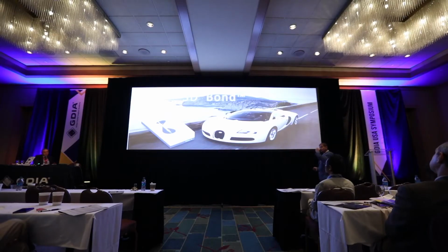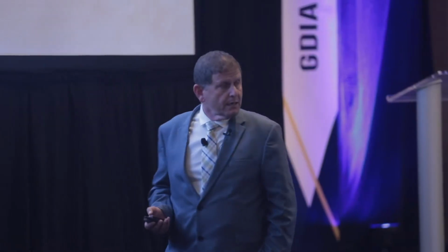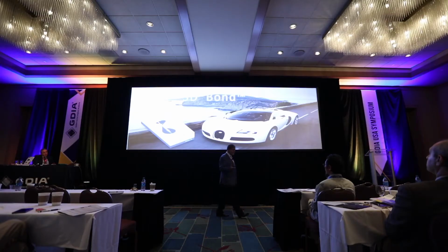Now, in order to remember, I brought this wonderful Bugatti car. High performance, but it cannot be off-road, which means that if you want to use the 3D Bond, the blue box, use it just within the indication. Indication: first central until second premolar, molar with a septum. Not when you have threads of implants exposed. Not when you have periodontal defects which are not surrounded by enough bony walls. It wouldn't work there.